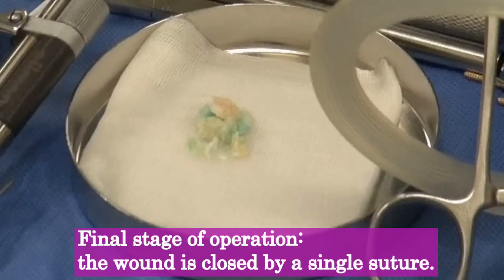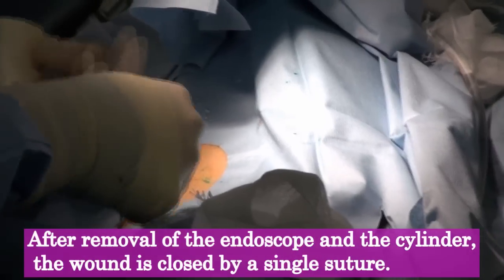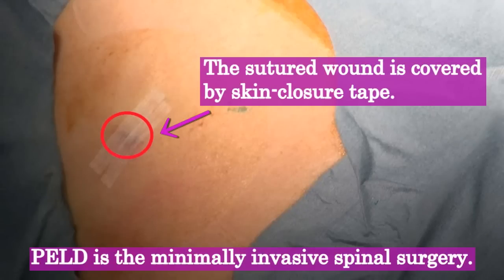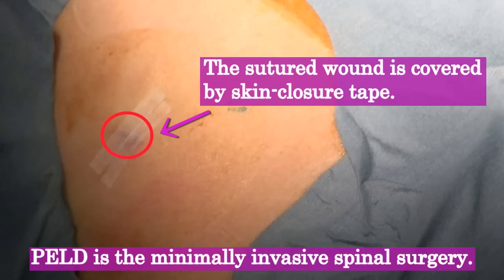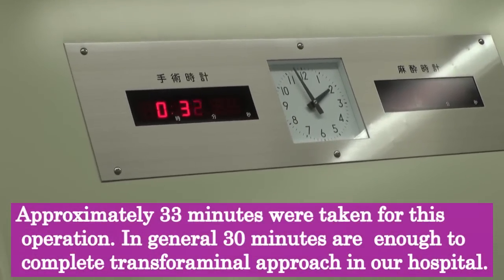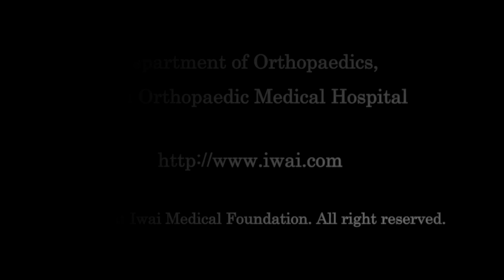This is the total amount of removed herniated disc material.